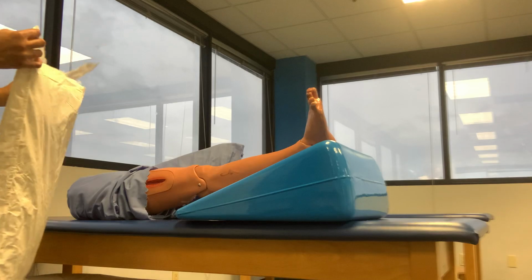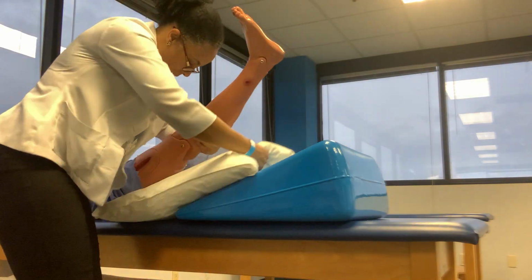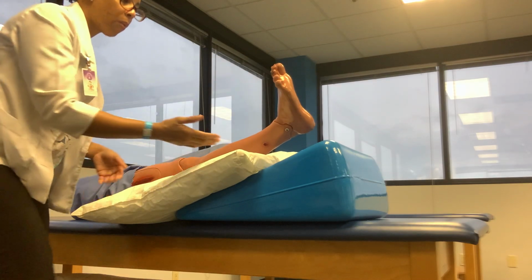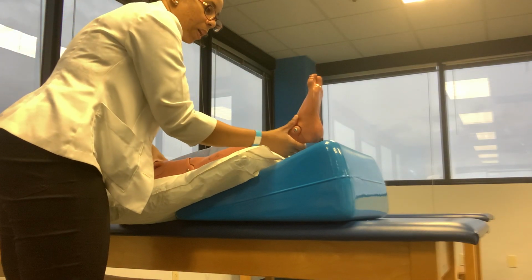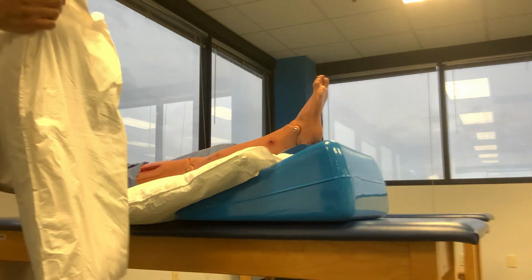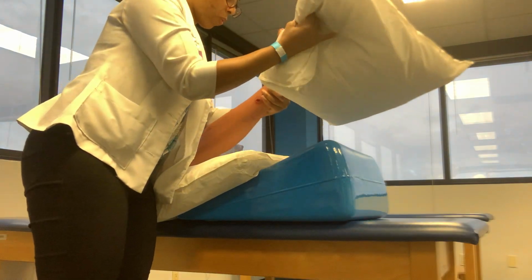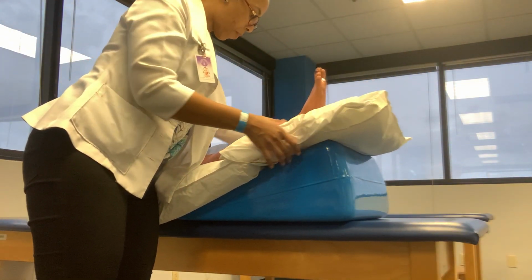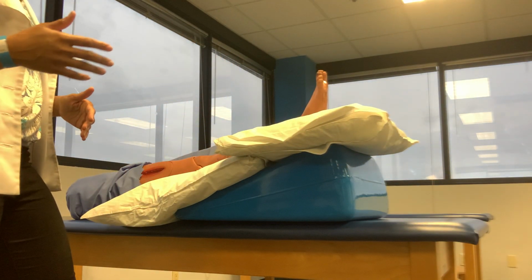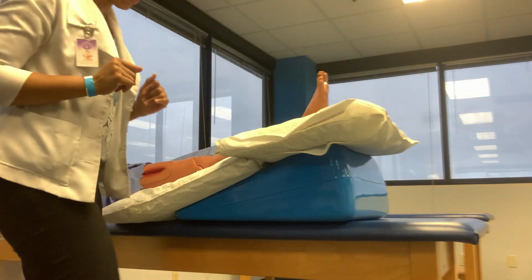So I get my pillows, and again, I carefully lift my patient's limb, and I get the pillows tucked all the way in. You want pillows all the way in to the gluteal fold, all the way up, having that limb completely supported the entire length of the way. Now there are also a couple of other ways that you can do it. You can also elevate the limb on just all pillows, but that will require quite a number of pillows, and it does take a little bit of practice to get everything evenly supported and making sure that your tower of pillows is level.